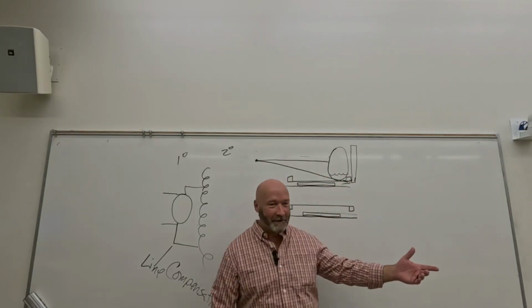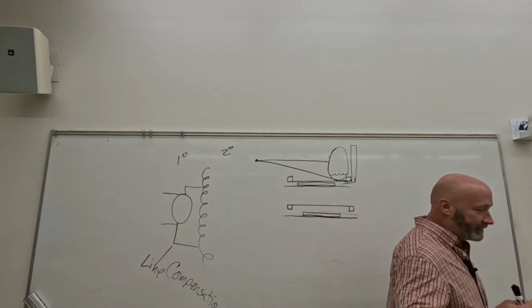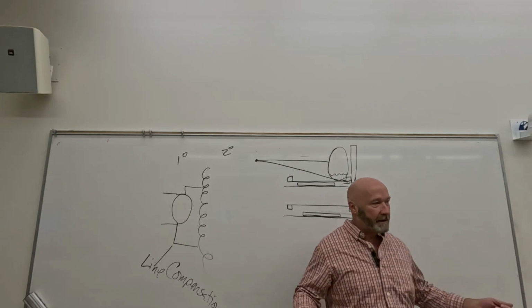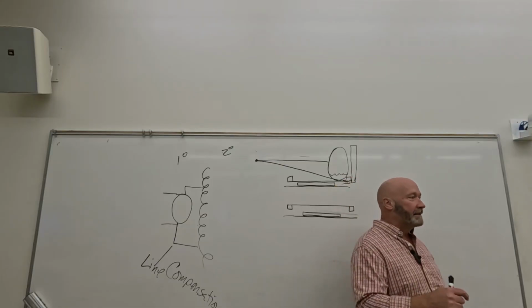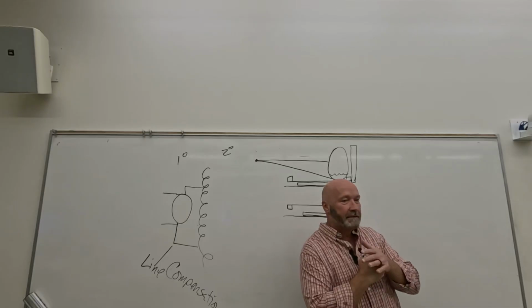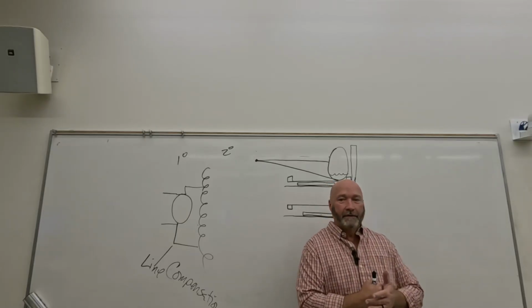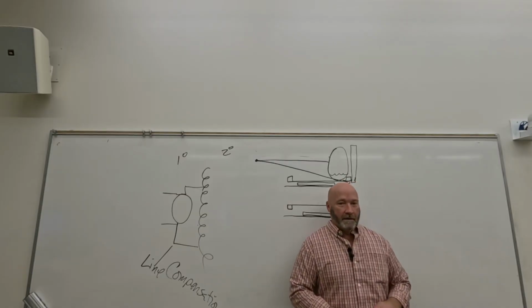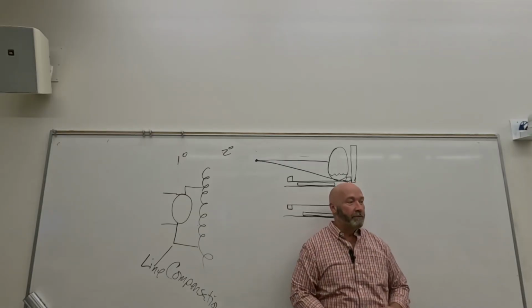All right, so it's solenoid. So you step on it, you hear the clack, and you can move it anywhere you want to. You get off of it, you hear the clack, and it locks into place. If that solenoid, or the thing that holds it still, starts to wear out, kind of like brakes on your car, and you lean up against that tabletop, bingo, that tabletop will run from you.